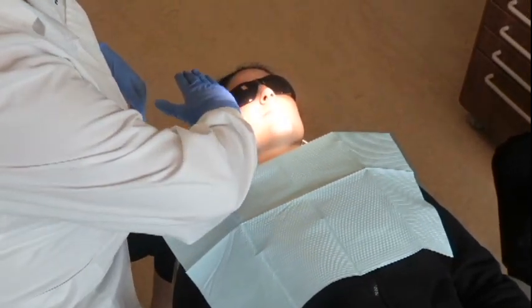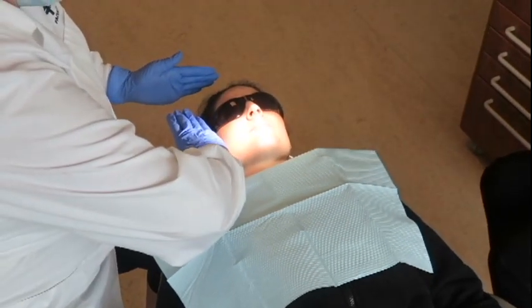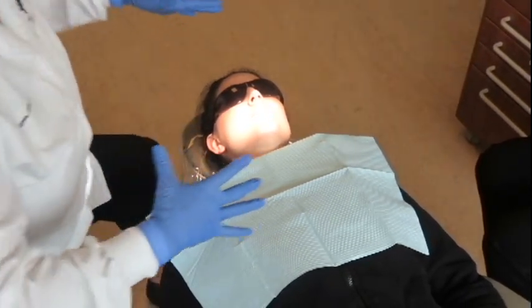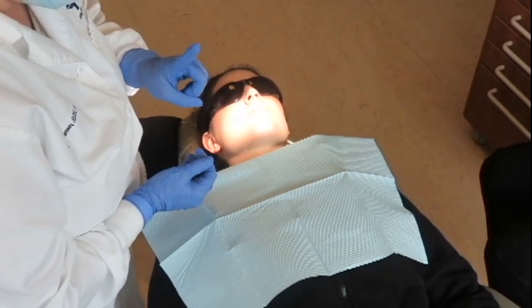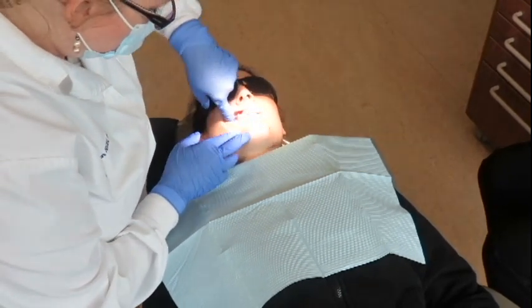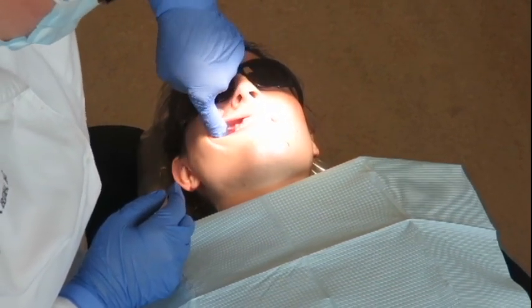The face has to be parallel because you won't be able to see your angles very well if their face isn't straight. Now that we're positioned, we're going to find our site. The first thing you want to do is feel for the site — palpate the mucobuccal fold until you find that zygomatic process, the zygomatic strut.